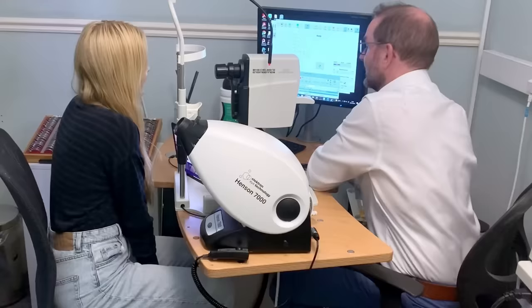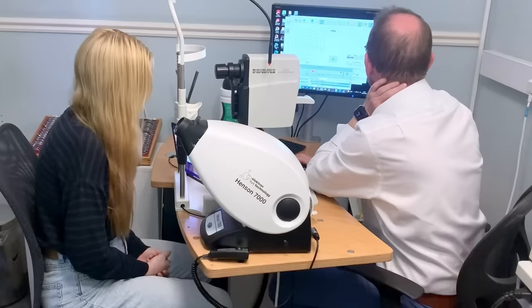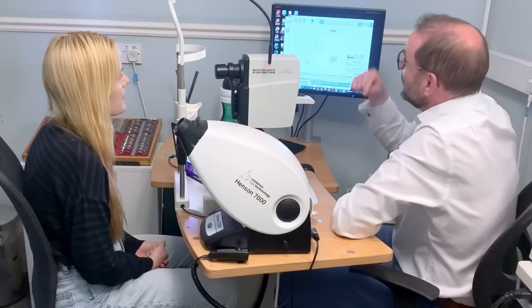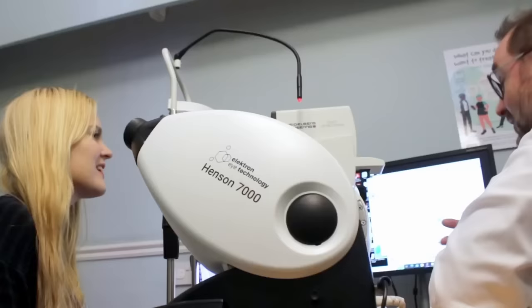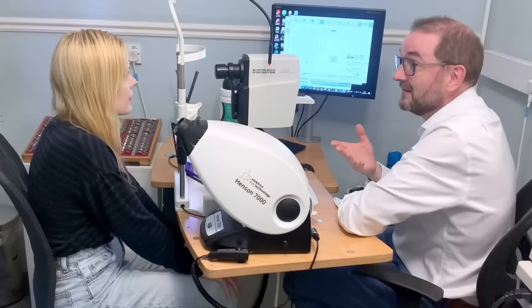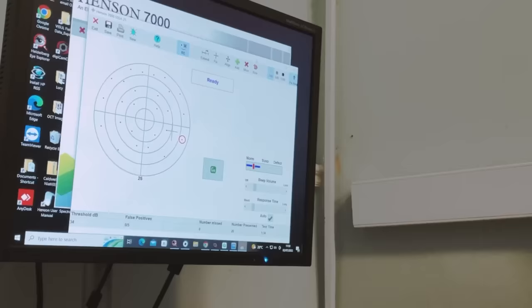Pressure after getting them all on the first time. I was too nervous. Some people get really nervous, especially with the visual field, if they've got glaucoma, because they don't want it to get worse. The more you miss, the more it shows with the details, so it can take quite a long time. Occasionally some older people fall asleep when they're doing it, so they can't concentrate, so you have to keep talking to them. It's quite hypnotic, isn't it? Especially if it can take 10 minutes on a detailed one if you miss a lot. Right, that's all good. That's that bit done. Thank you so much. That's okay.